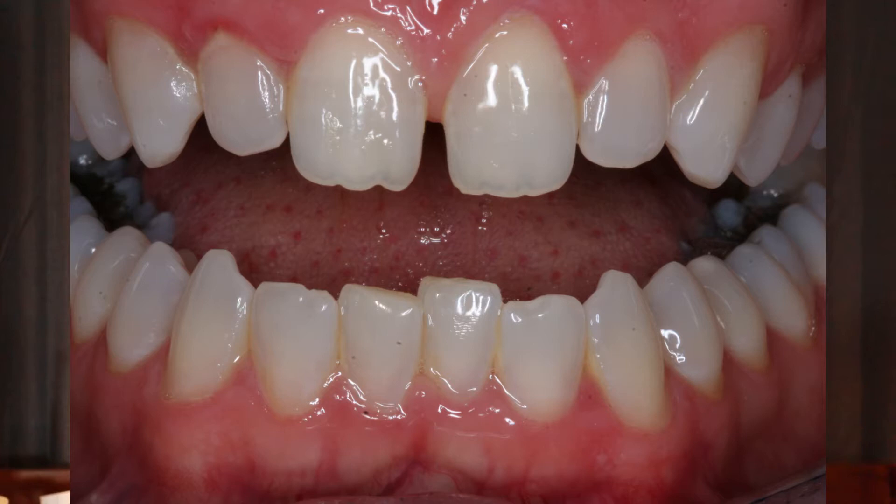An Inman aligner is an aligner and retainer all in one. It can be used to straighten mildly crooked teeth, and it works particularly well to straighten lower front teeth that are crowded together. As you can see in my before photos, my lower front teeth were crowded together and one tooth in particular was being pushed back a bit. I didn't like how it looked, so I took some molds and had an Inman aligner made to straighten out my teeth.